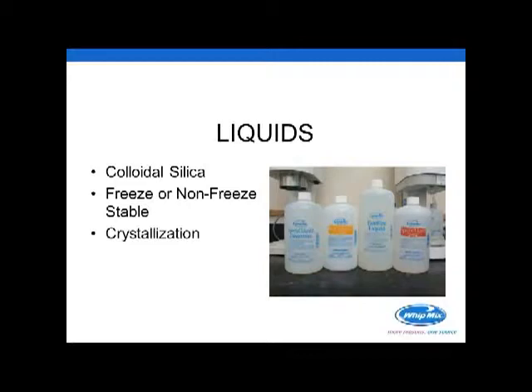You've actually seen some that are a little different colored. Some are colored pink. Some have a light yellow color to them. That, in general, is an additive. The yellow is, for some colloidals, very much a natural color. The pink is not, and is added to it for that individual manufacturer.